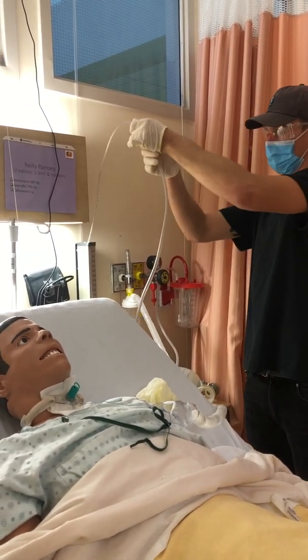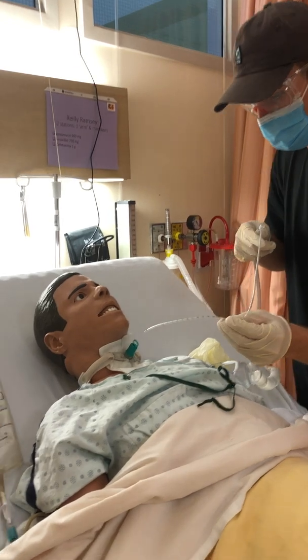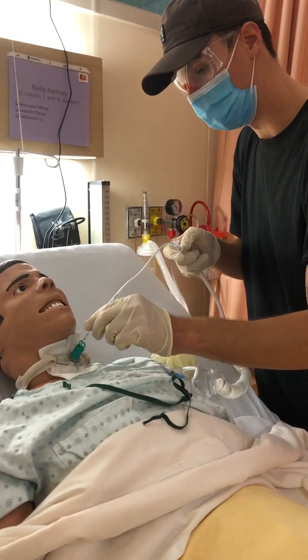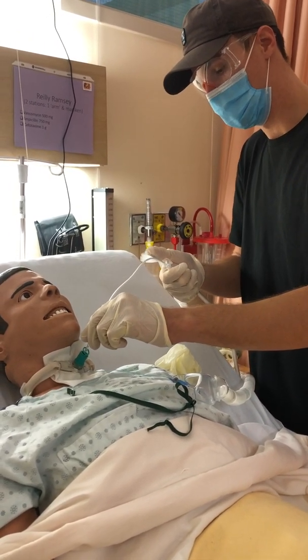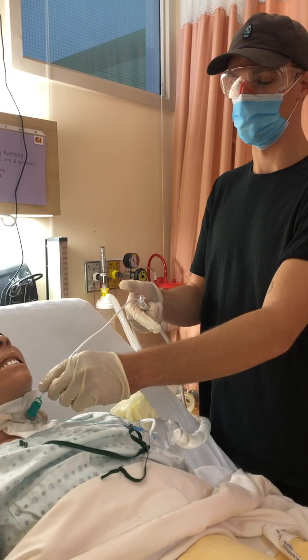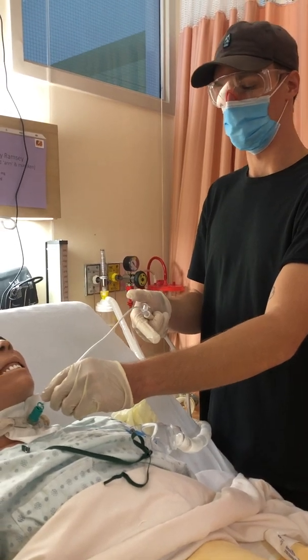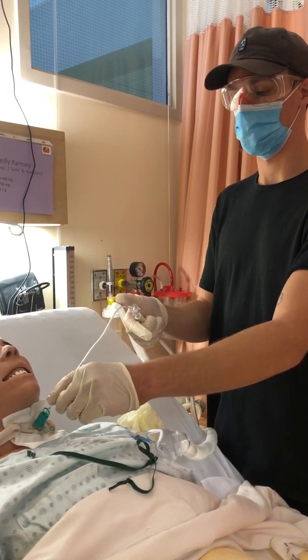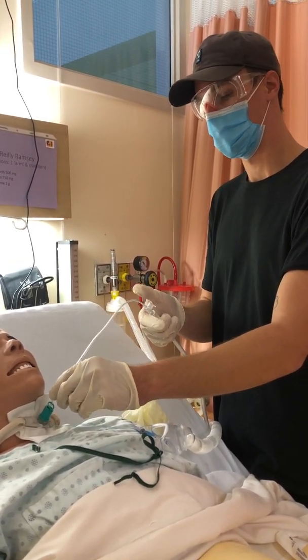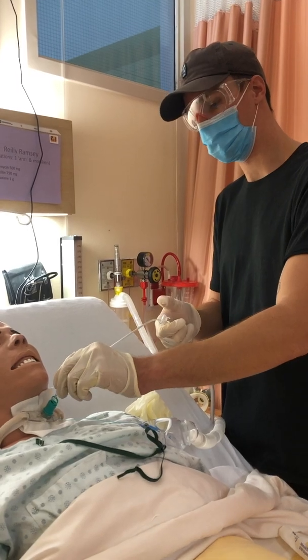I'd have a garbage here, and then I can touch this about 5 to 6 inches from the tip. When I insert this, I'm going to make sure I'm not touching anything on the exterior of the trach. I'm going to go until I feel resistance, and then I'm going to start suctioning. Before doing this, I'd be measuring the patient's O2 sats and make sure they don't drop, and again, I asked them to take a few deep breaths just so they can saturate themselves. Then I'd insert this until I feel pressure, and then I'd suction intermittently, and I'd rotate for about 15 seconds, again keeping my eye on the O2 sats.